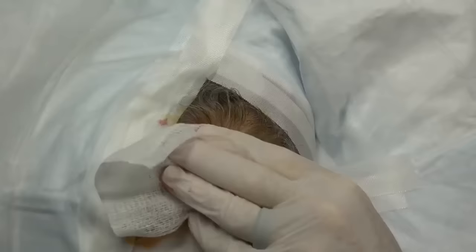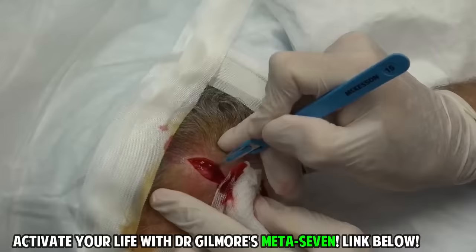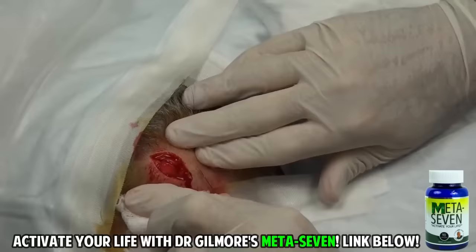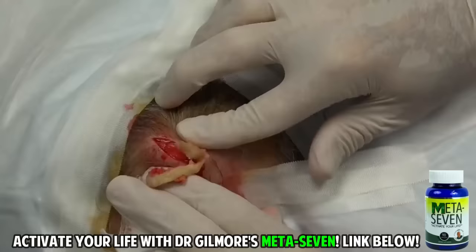Now we're down to where the cyst is, and that's the magic of it all. We're going to make an incision across the cyst, and then we're going to remove it. Let's get a little squeeze here — a little pressure, my friend. We're going to empty this. This is full of material, proteinaceous material that's been built up in here for a while.